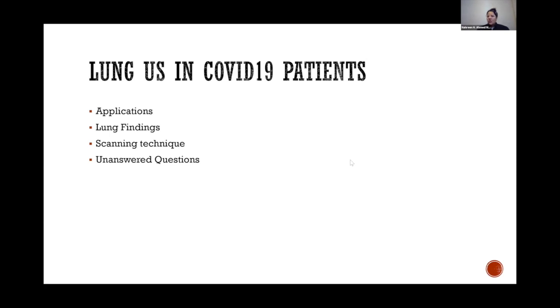It's especially important to re-examine them throughout their course if there's any change in their hemodynamics. A lot of what we're seeing is that in the beginning, maybe we'll see a trace pericardial effusion, but then as things progress, we are seeing patients in biventricular failure and cardiogenic shock. So we are seeing that in some of the more severe patients. So certainly serial echo exams when they're clinically warranted is very important as well. But I think that's a great point to make.